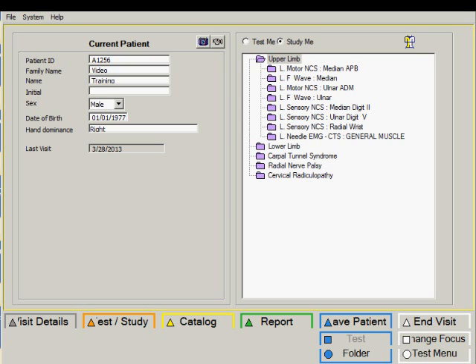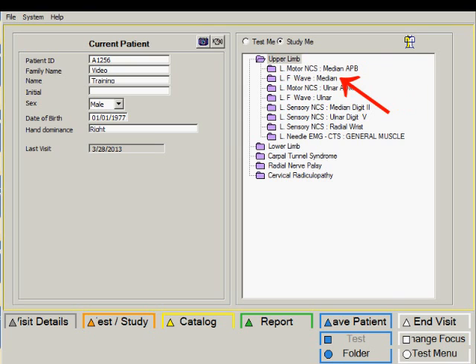So instead of calling upper limb, the study folder could be called Dr. Johnson studies and so on. The studies contain electrodiagnostic procedures that are highly customized. For example, if we look at the first entry under upper limb, it indicates it's a motor nerve conduction study on the left side and for the median nerve. And the next examination is an F wave study on the median nerve and on the left side.